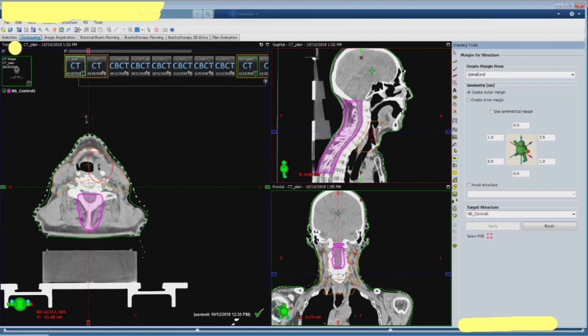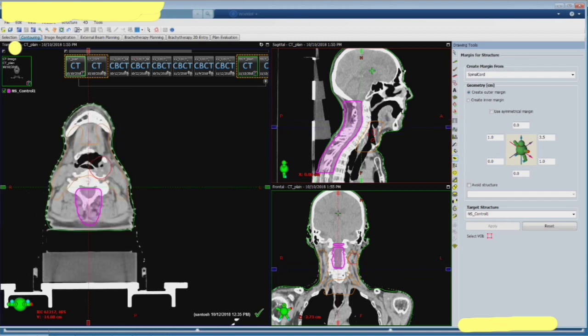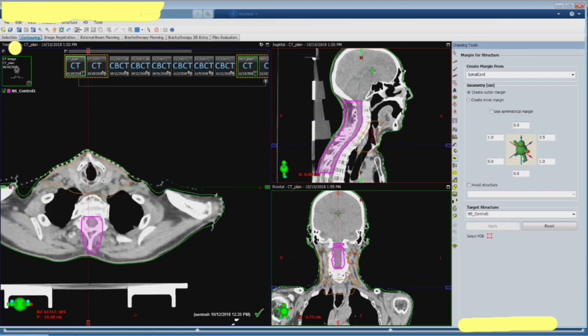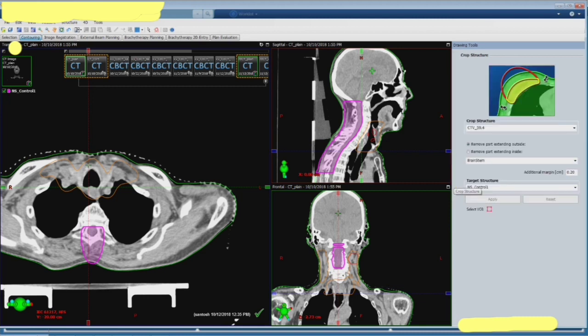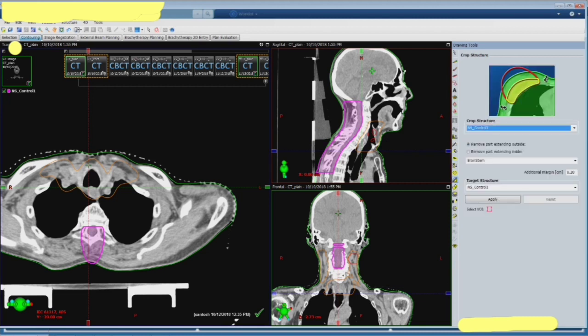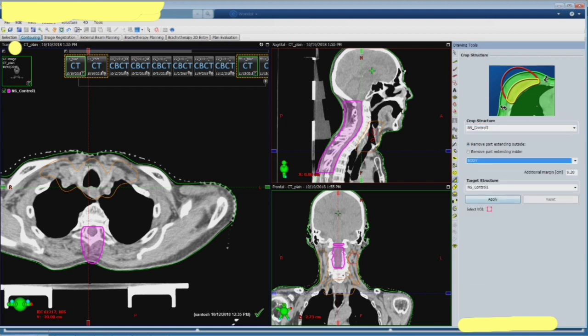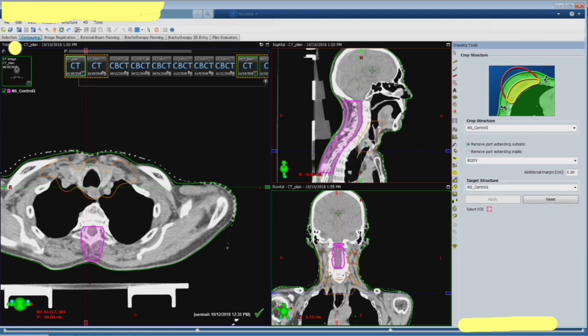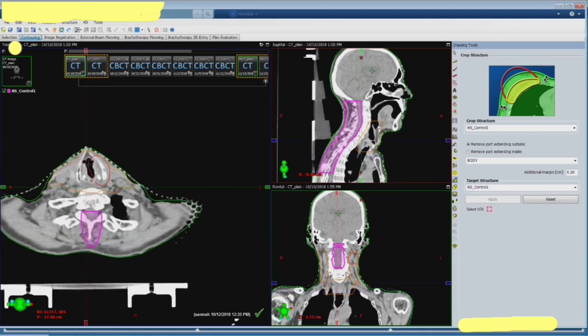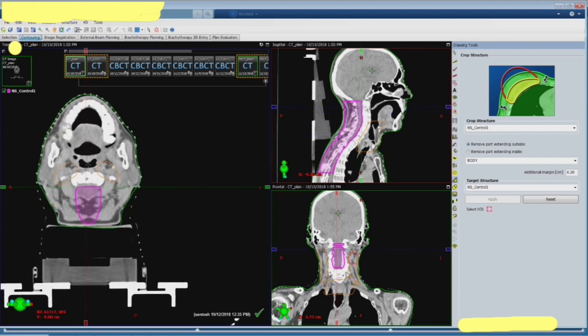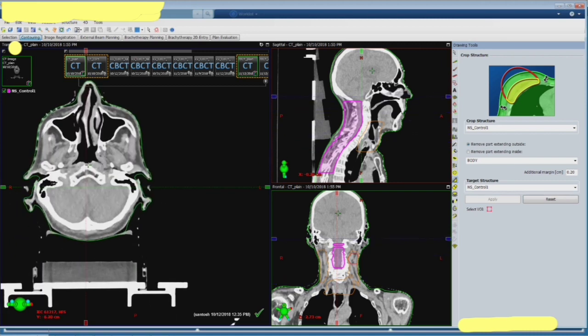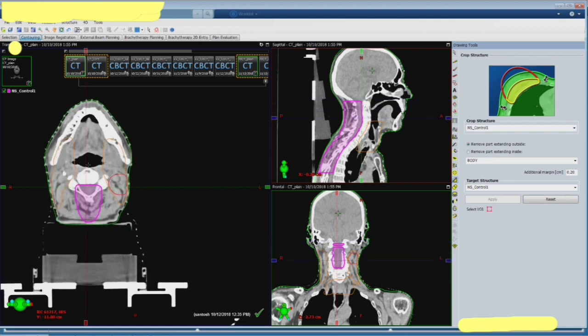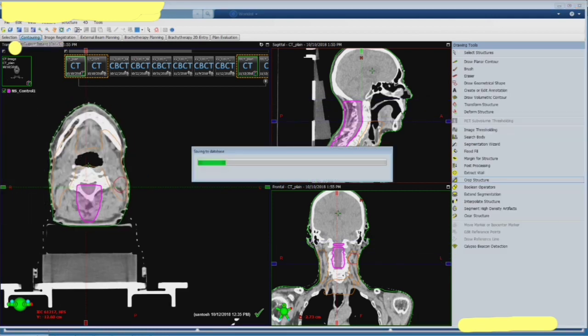And I'm going to crop that particular control volume from the other one what we had. You have to do this because it's going to trouble you if it is overlapping and then the constraints that you give in optimization, that's going to trouble you actually so it's better to crop that.